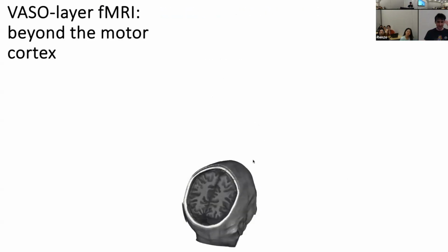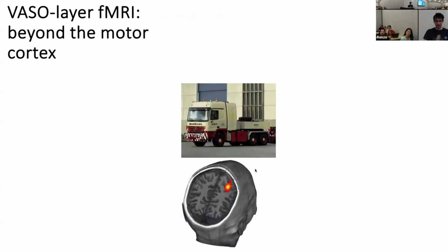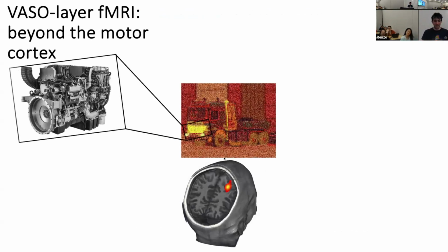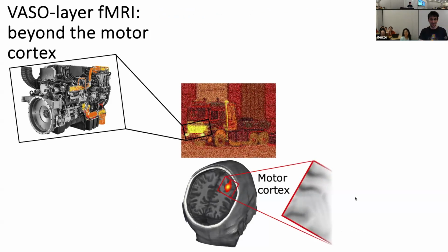So I showed you this metaphor of the truck engine: when we look at a part of the brain with low resolutions, it's like trying to understand a truck engine with an infrared camera. Now with the high resolutions that we get, we actually have an idea of where signal comes in and where information flows out, namely looking at these different little stripes of the motor cortex.